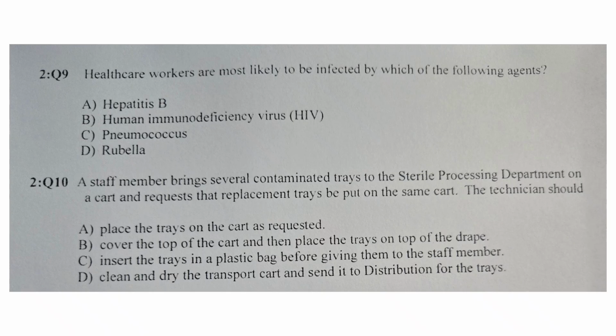The correct answer is D. All right, so if a staff member brings several contaminated trays to the SPD department on the cart and requests that replacement trays be put on the same cart, the technician should ultimately clean and dry the transport cart and then send it to distribution for the trays. All right.